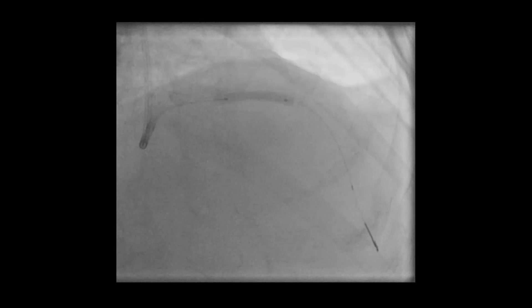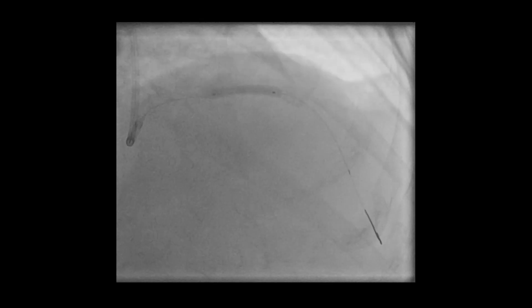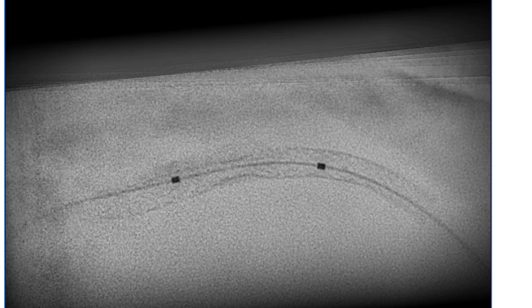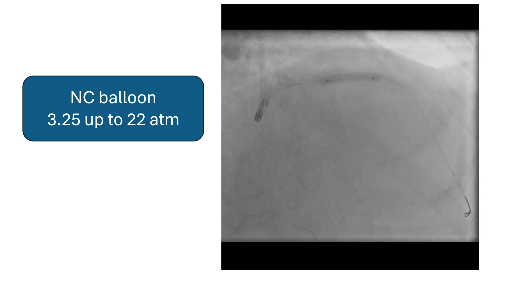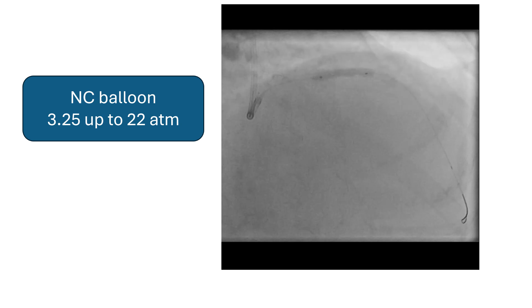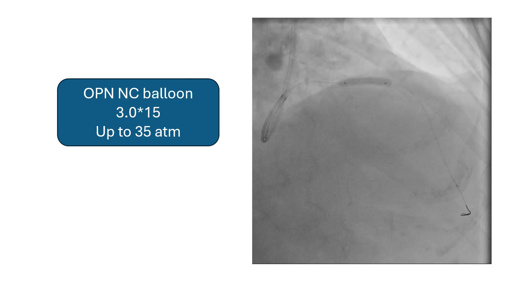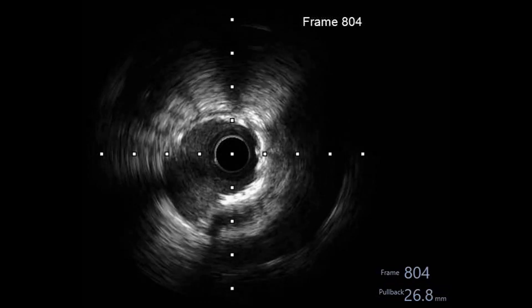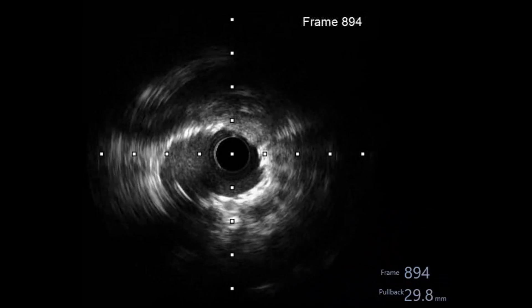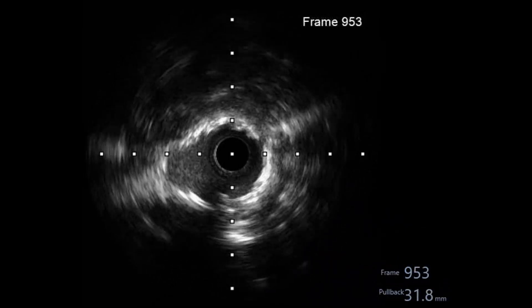Stent boost showed a significant focal underexpansion of the stent. So post-dilatation was done by a 3.25 balloon up to 22 atmospheres. Then an OPN NC balloon 3 by 15 was used, inflated up to 35 atmospheres. The IVUS clearly showed an underexpanded stent even after the OPN balloon. The proximal part is well expanded.